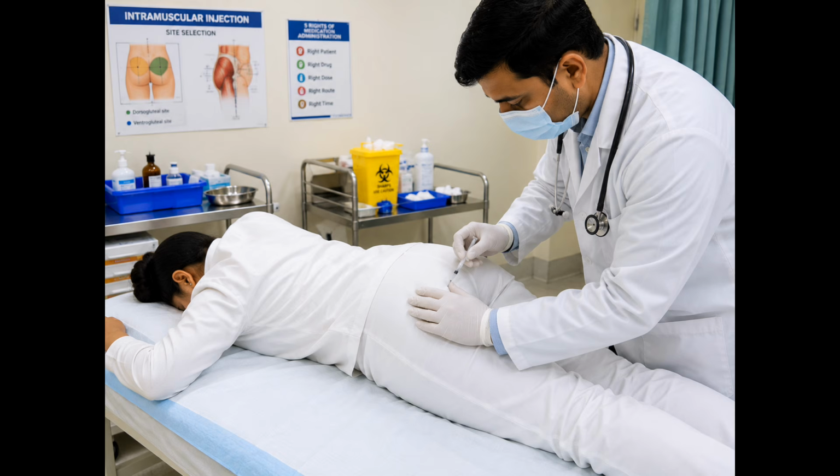The patient is then positioned comfortably according to clinical practice. Healthcare professionals use accepted anatomical landmarks to identify the appropriate gluteal injection site. Site selection depends on the medication being administered, the patient's age, body size, muscle development, and institutional policies. Proper anatomical assessment is a skill developed through professional education and supervised clinical training.